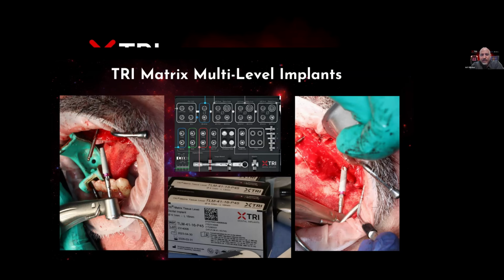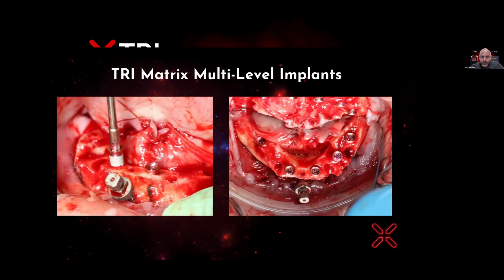of the scan body. The other thing that you'll notice is a nice feature is that it has this concave surface. The concave surface is nice because it's more narrow at the crest in those areas than the actual implant body. So what that allows for is for blood to kind of seep into that concavity, and it really minimizes the stress that's being put on the crestal bone there to help preserve bone.